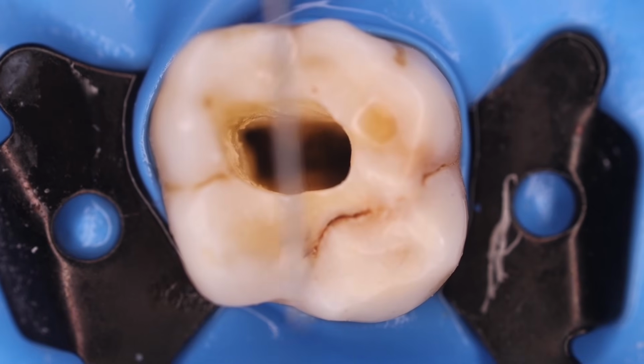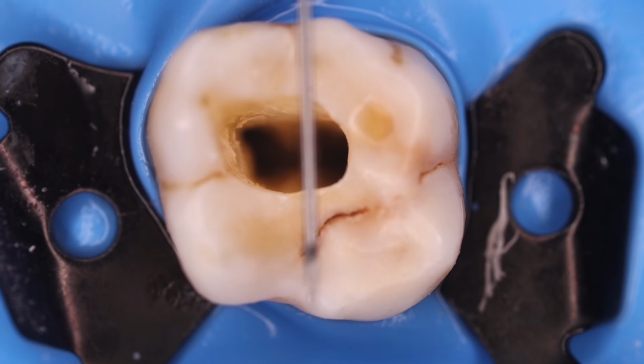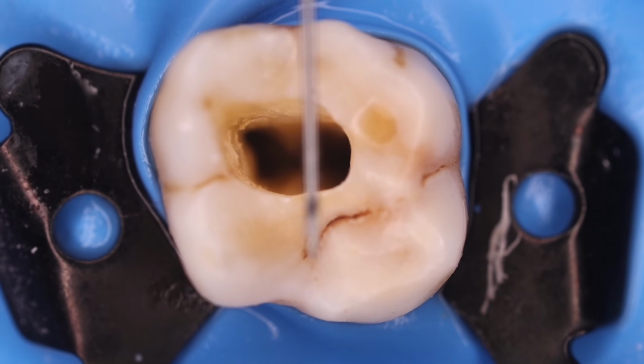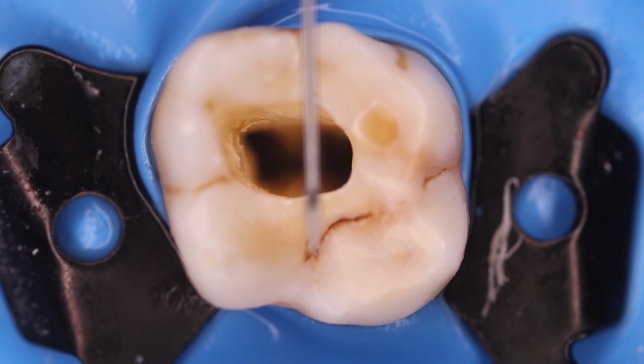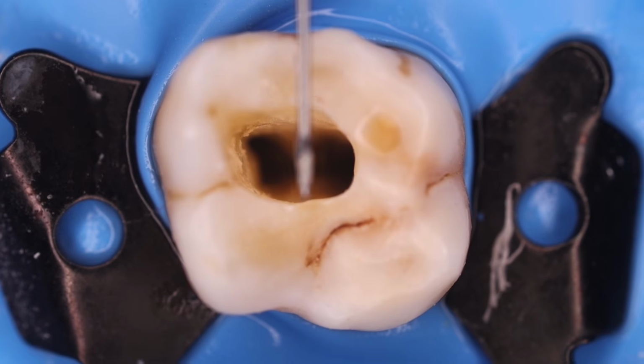So now we are going to enlarge the canal orifices with the help of Gates Glidden drills. This is the size 1 Gates Glidden drill, and we will move subsequently up to size 3 as per convenience to enlarge the canal orifices.